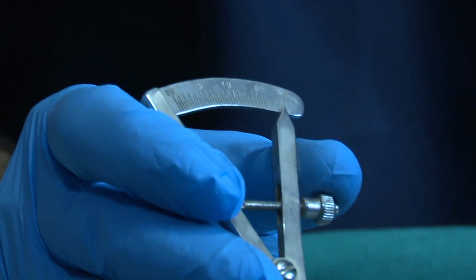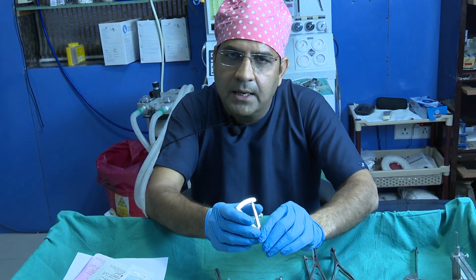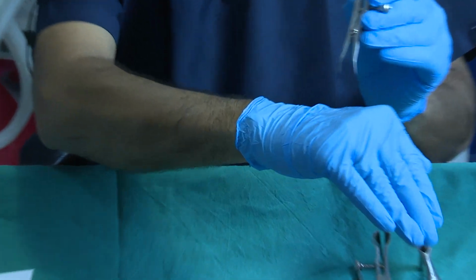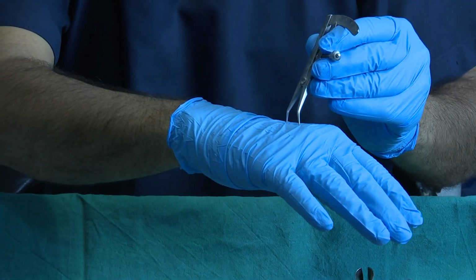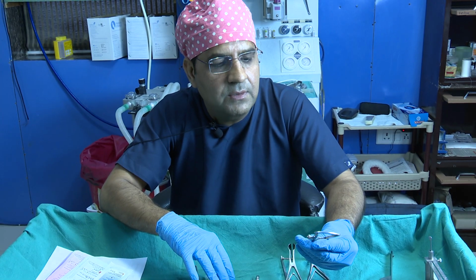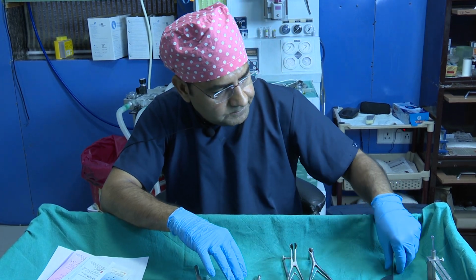So ideally we should preserve around 8 to 10 mm in an Indian thick skin patient. So we just measure it, mark it with betadine or something like this, and then the rest we excise. So this is a good instrument for the lateral crura excision.